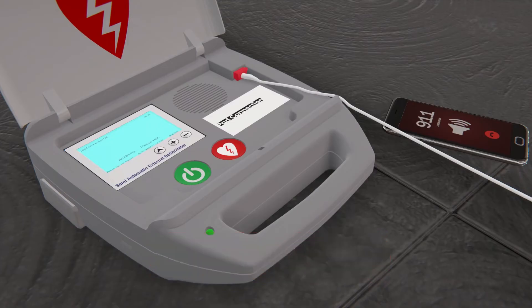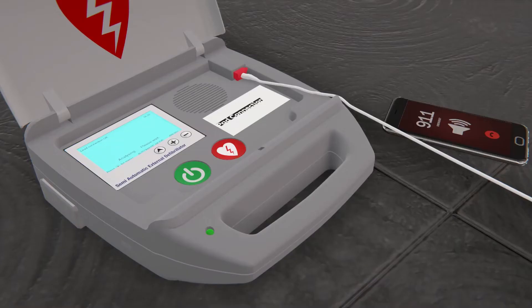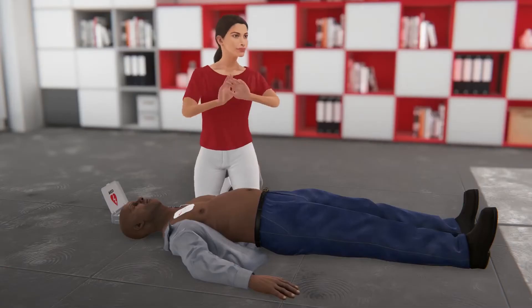Follow the prompts and let the AED analyze the heart rhythm. Do not touch the patient, and make sure that no one is touching the person.